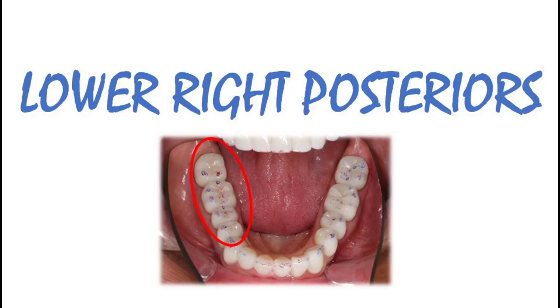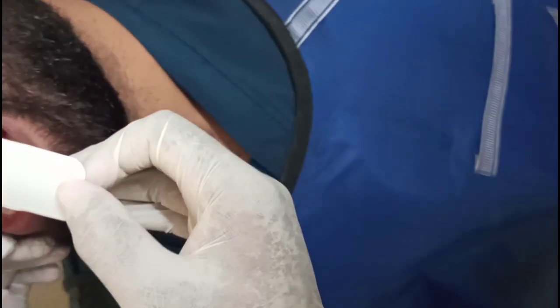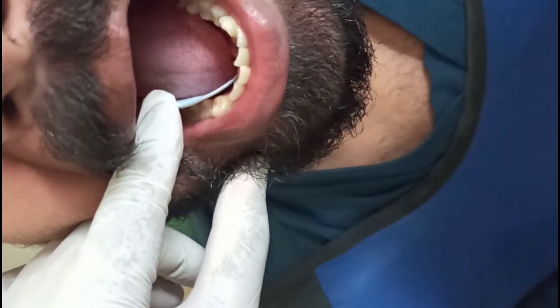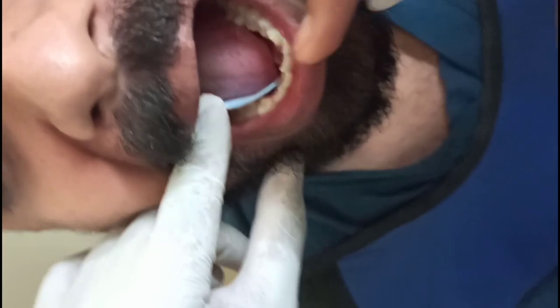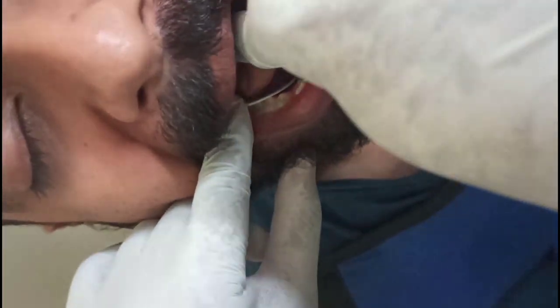For lower right posteriors: note I am standing in the seven o'clock position with both my right and left hands on the right side of the patient. I am placing the film inside with the right hand and holding it with my left hand index finger on top of the film until the patient takes over to hold the film.